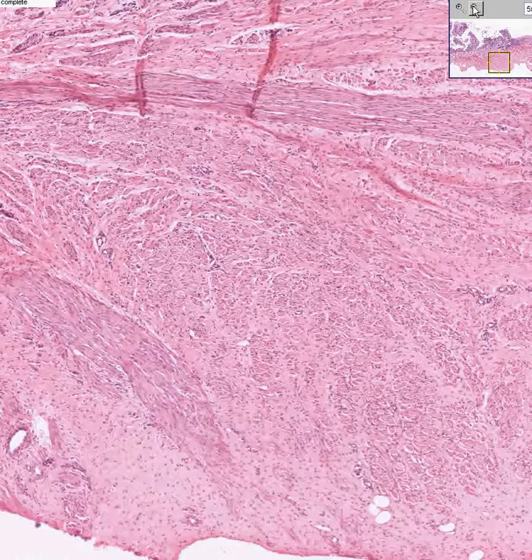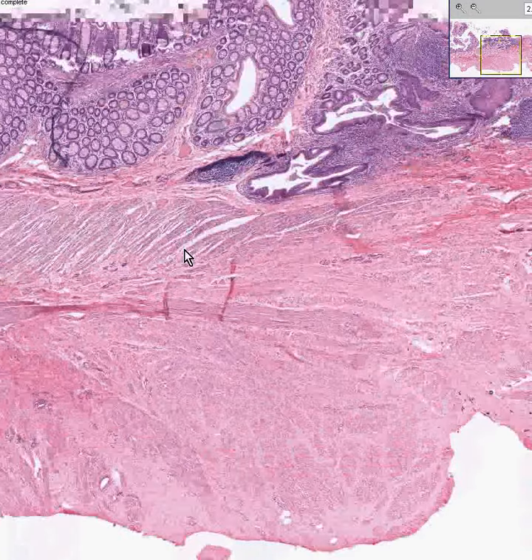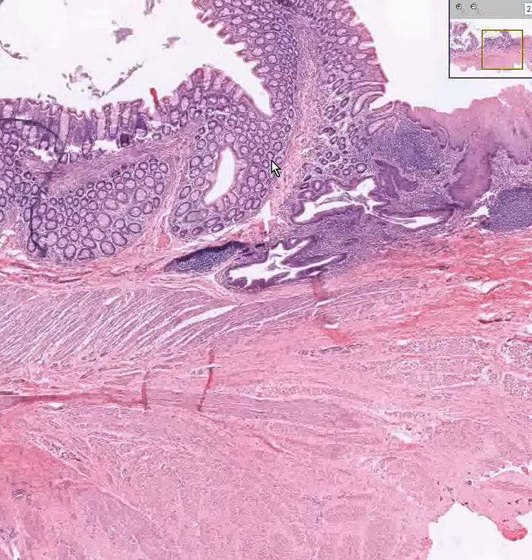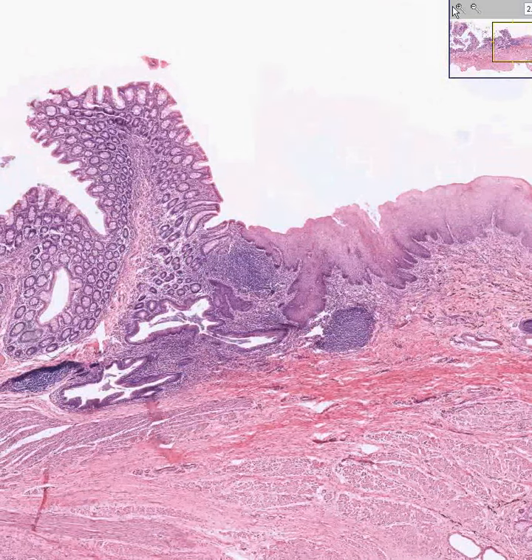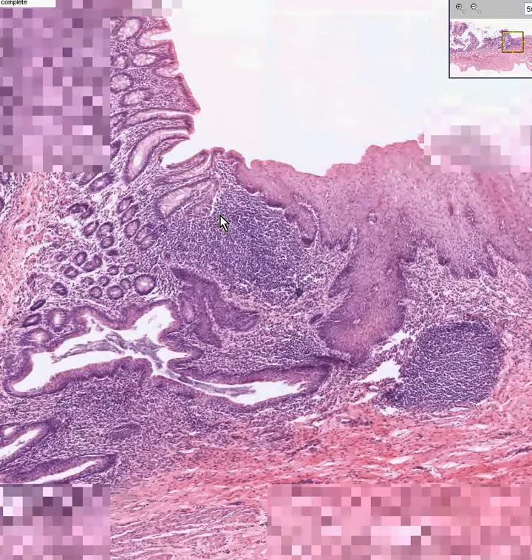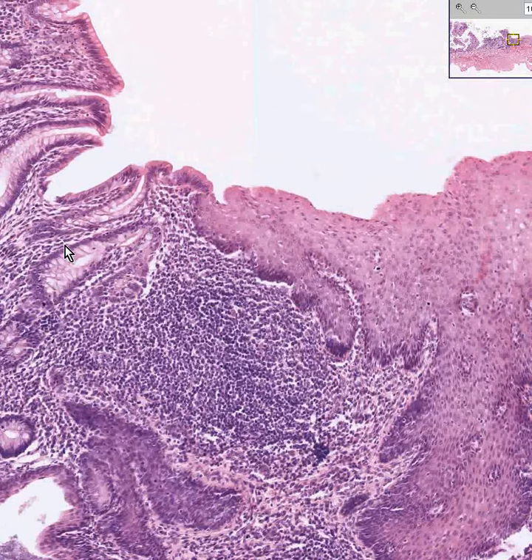This is a squamocolumnar junction of the rectum and anus. The precise location is also called the pectinate line. Notice you could actually boil down the actual area to a single cell because you know all of these are your columnar cells of the rectum and your squamous cells of the anus.